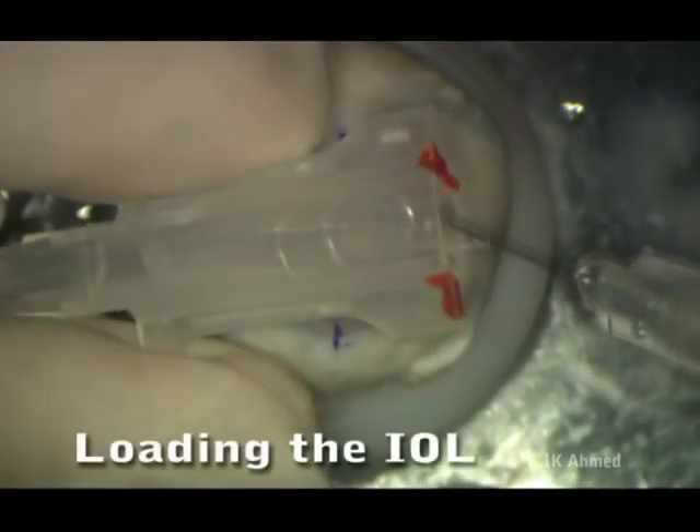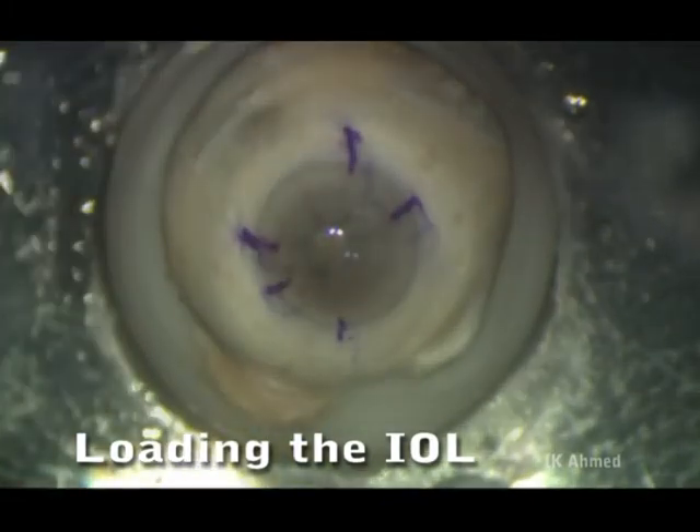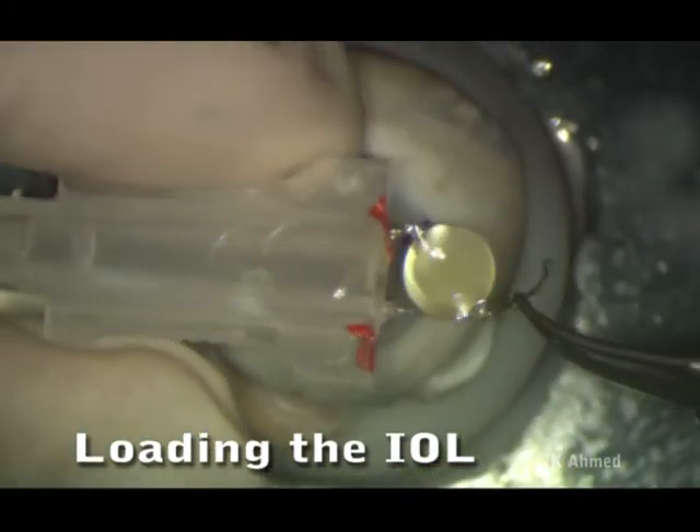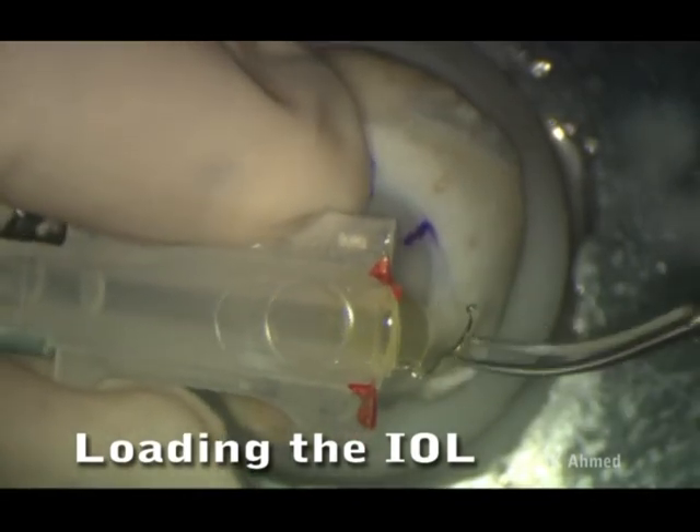During the wet lab, we will perform a corneal incision, fold the intraocular lens and load it into a cartridge, and inject it through the incision into the anterior chamber. However, we will not be rotating the lens, as this is difficult to do in cadaveric eyes.